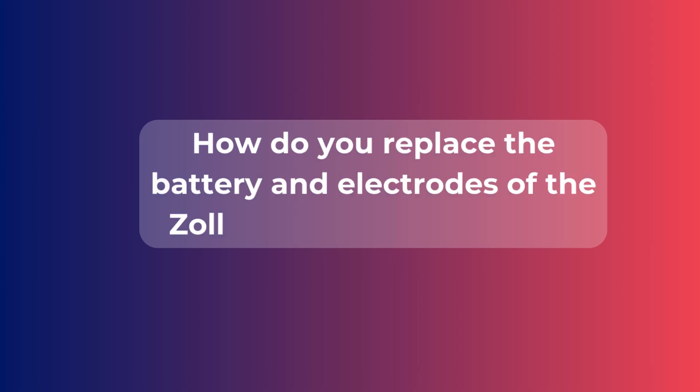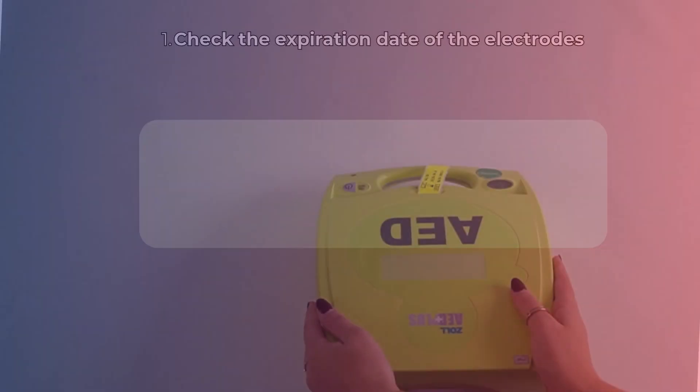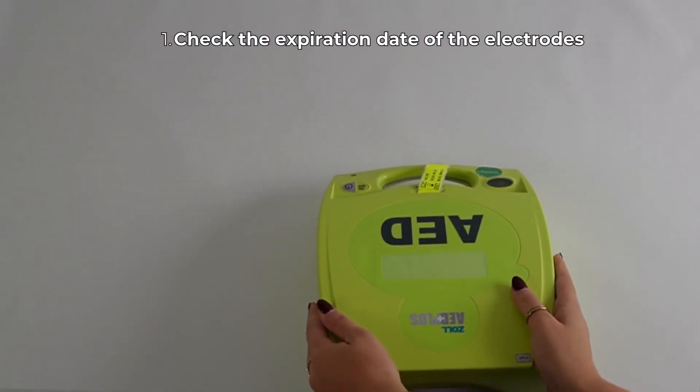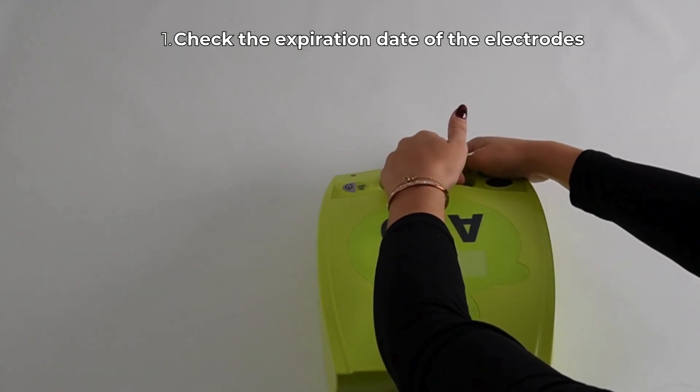How do you replace the battery and electrodes of the Zoll AED Plus Defibrillator? Find out in this video. First, check the expiration date of the electrodes. It can be found on the yellow tab, as well as on the back of the electrodes.